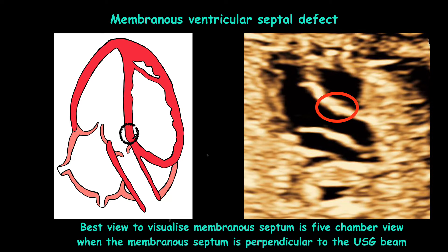Now let us see the membranous ventricular septal defect. It is best visualized in the five-chamber view. Here you can see the line diagram of the five-chamber view as well as the ultrasound image of the five-chamber view — these are all normal images. We prefer the five-chamber view because in this view the membranous septum is perpendicular to the ultrasound beam.